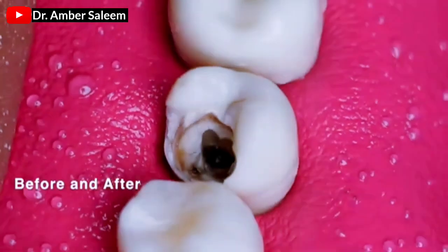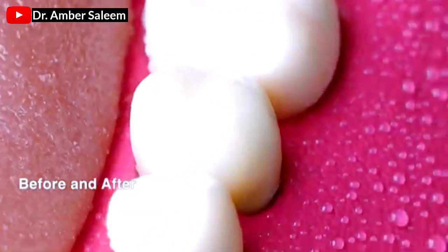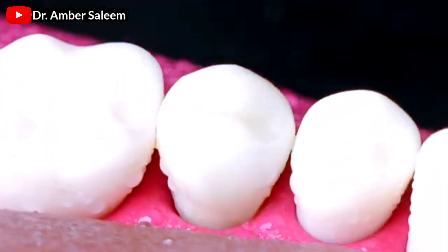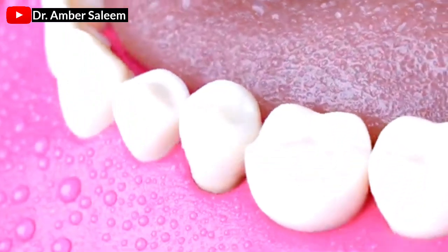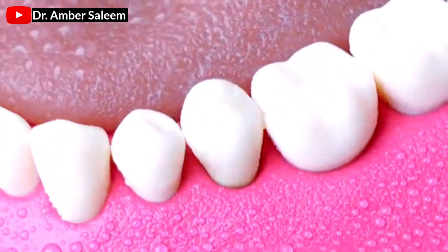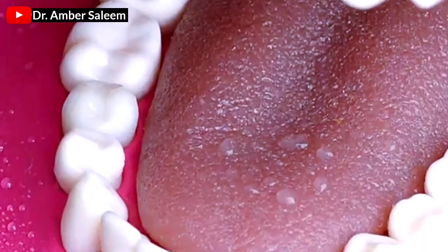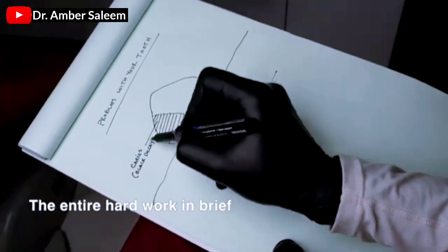Before and after. The entire hard work in brief.